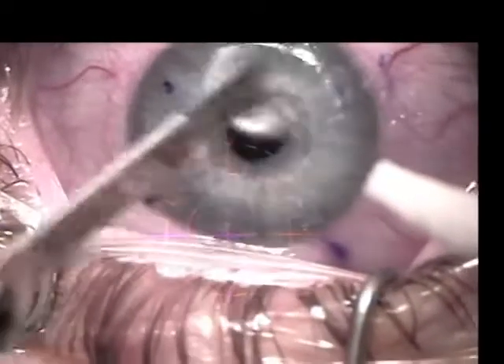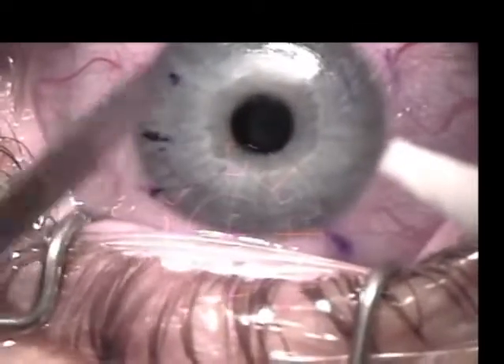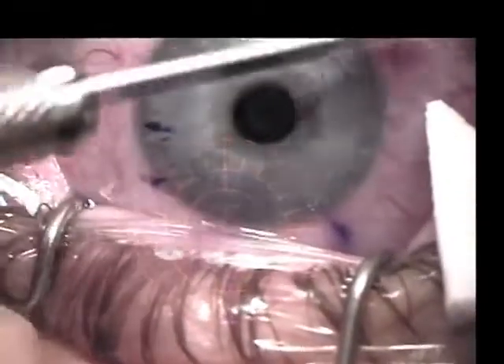A beaver blade is then used in a similar fashion, again attempting to remove all epithelium from the stromal bed and posterior aspect of the flap.